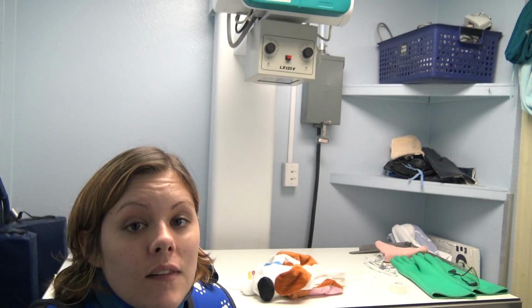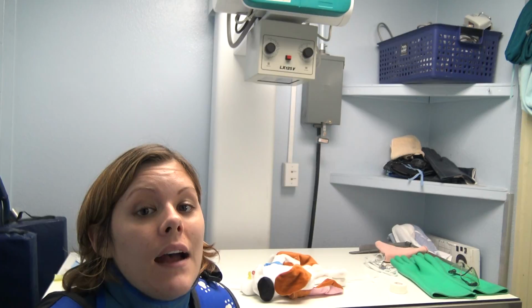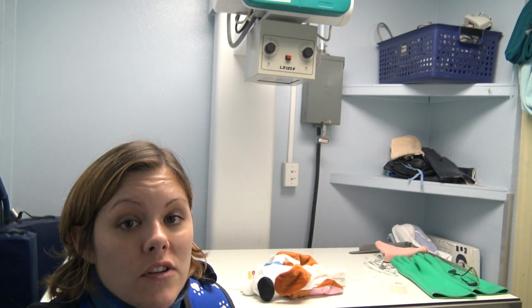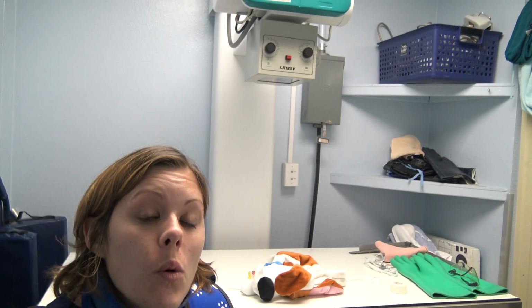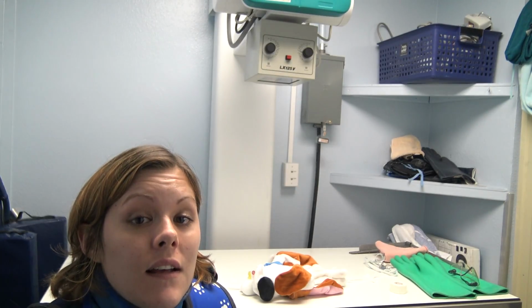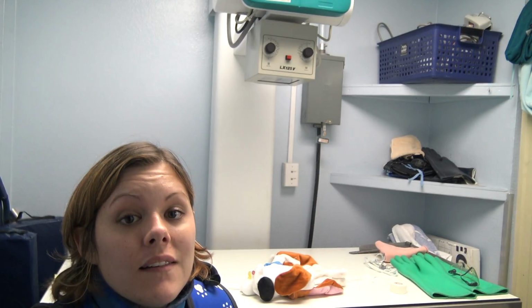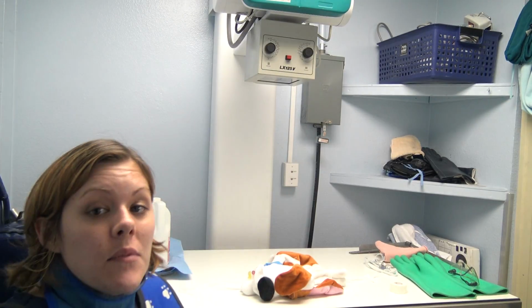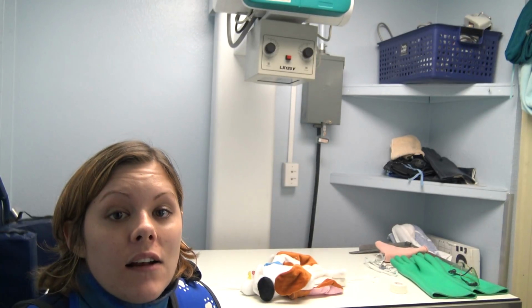Typically at 15 minutes the barium will be in the stomach and the duodenum. At 30 minutes it'll be in the stomach and some of the small and large intestines, and so forth. It would keep traveling until it hit the colon. If there's not gastric emptying in 30 to 60 minutes, it's considered slowed. So I'll demonstrate positioning the patient today and collimating.